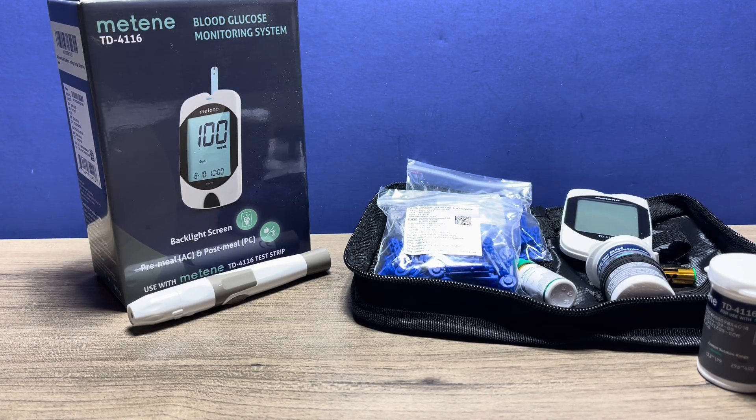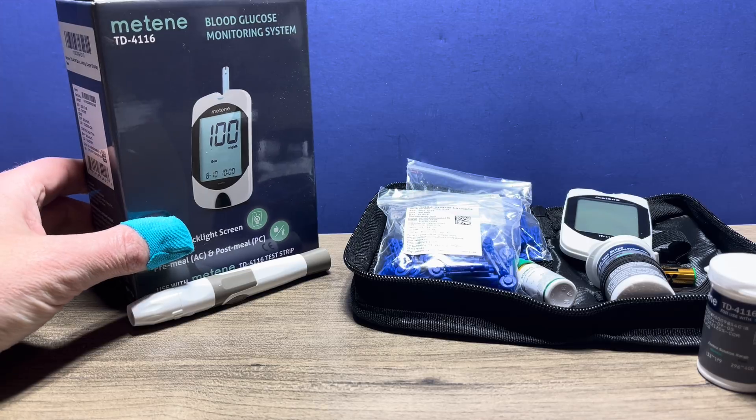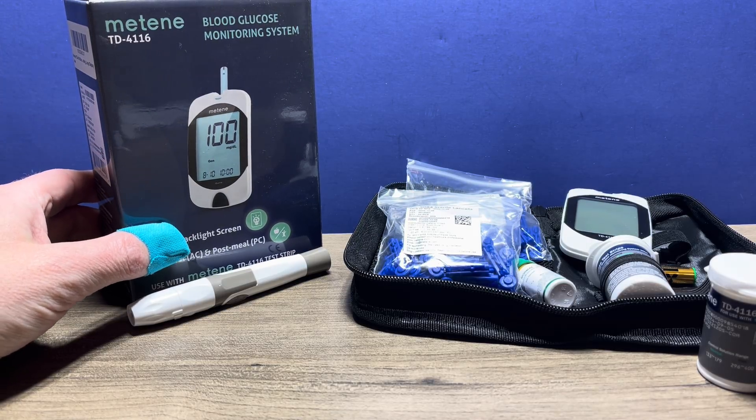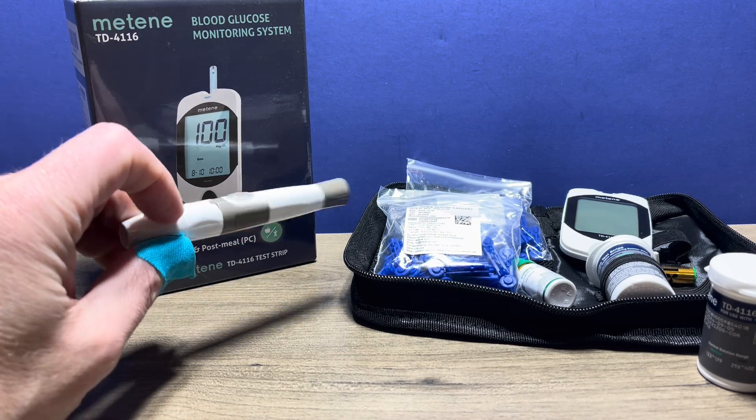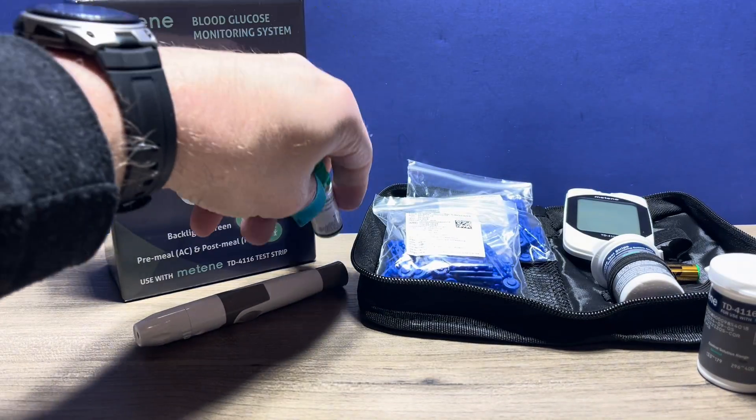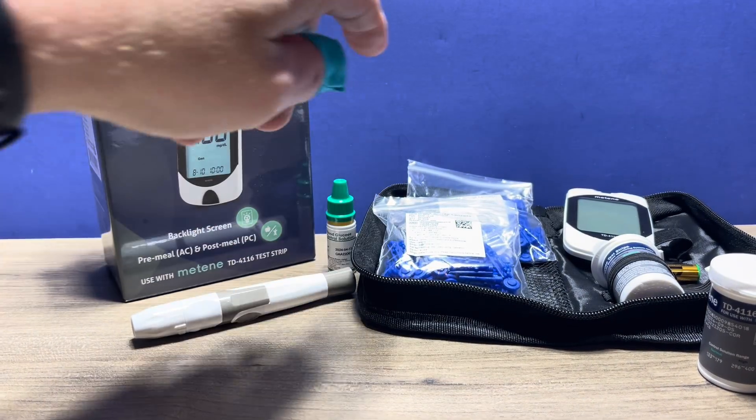Hi, this is Josh, pharmacist with Learn Blood Sugar Testing. I'm going to take a look at how to set up and use the Mateen blood glucose monitoring system, the TD 4116 glucose monitor. I do have separate videos on showing how to use the lancet device as well as the control solution. You can check those out if you need to.